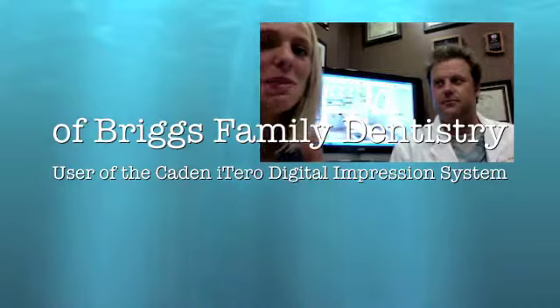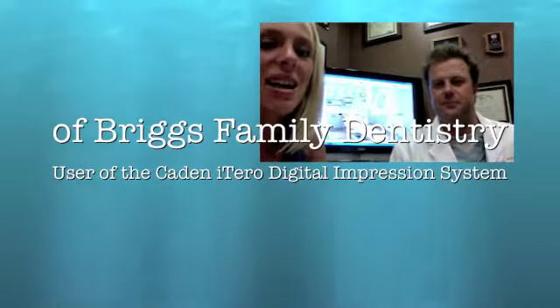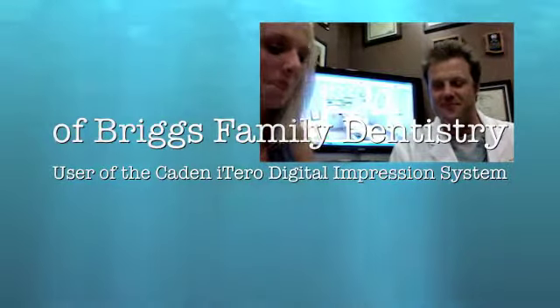With Dr. Bradley Briggs of Briggs Family Dentistry in Scottsdale, and we are going to be discussing the iTero system. Dr. Briggs, what type of procedure is the iTero system used for? We use it to make crowns, inlays, onlays. When we restore a tooth, it makes the porcelain that we put over the tooth.